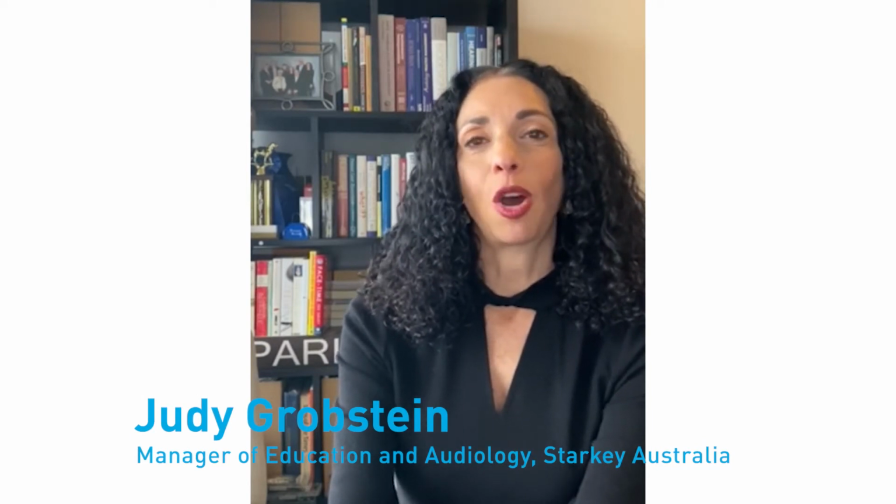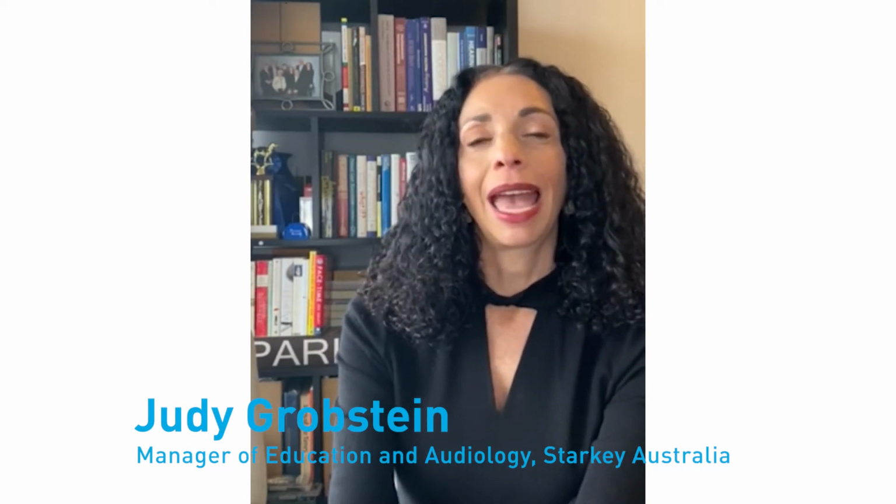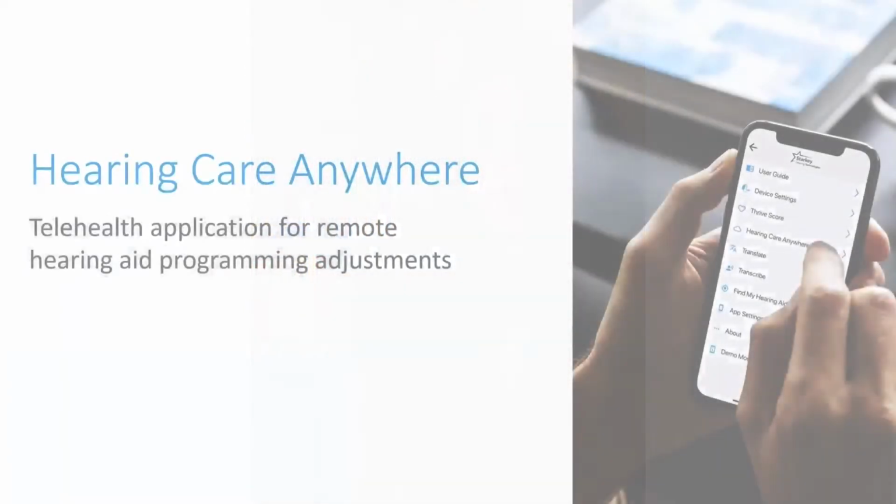Hi, my name is Judy Grobstein, Manager of Education and Audiology at Starkey, Australia, and I'm here today to talk to you about Starkey's approach to real-time remote programming capabilities with Hearing Care Anywhere live sessions.